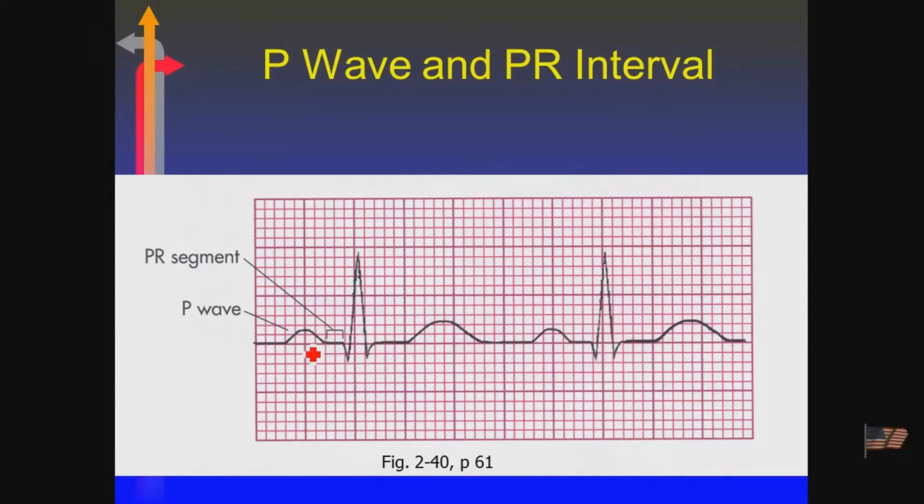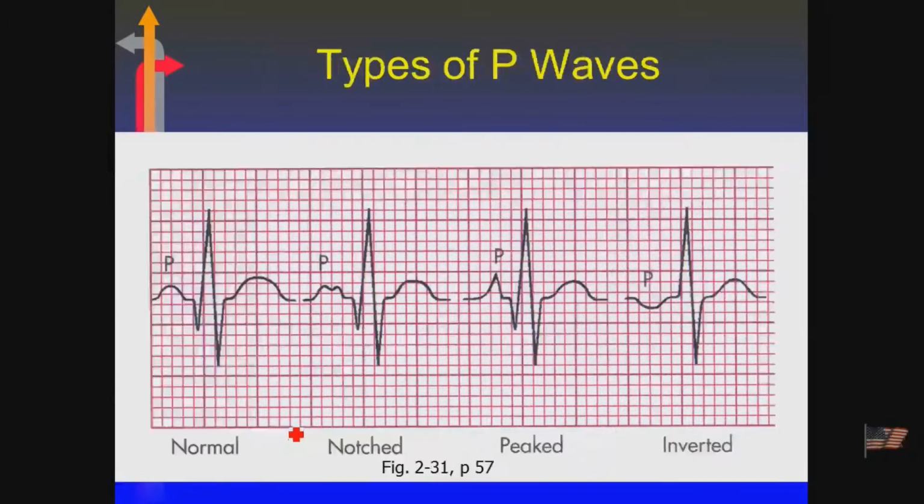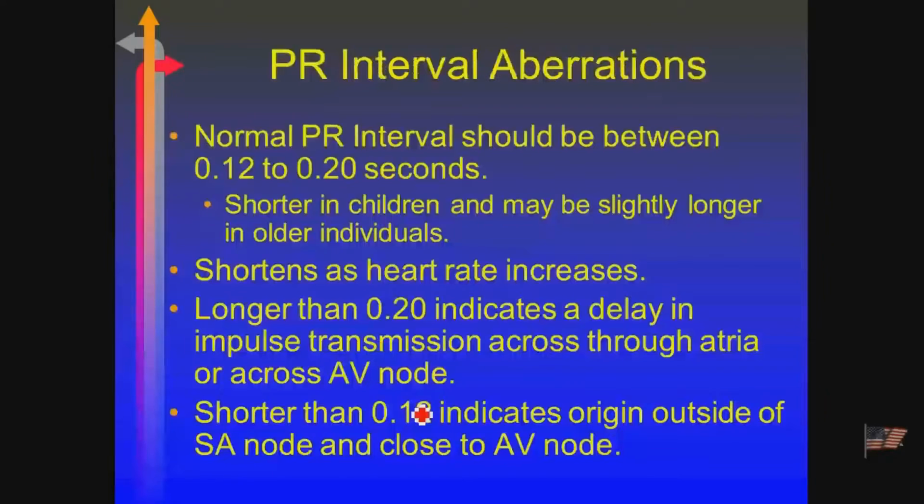So let's take a look at the P wave and the PR interval. Again, here's my P wave, here's my PR interval. And P waves can look different at different points in time. Normally it should be just a nice rounded positive deflection. Sometimes there's a second impulse in there and it's got a little notching to it. Sometimes they're tall and peaked, sometimes they're inverted. They're all P waves, but they're showing a different shape for a reason. There's something behind that reasoning.